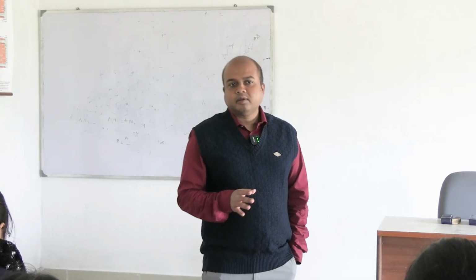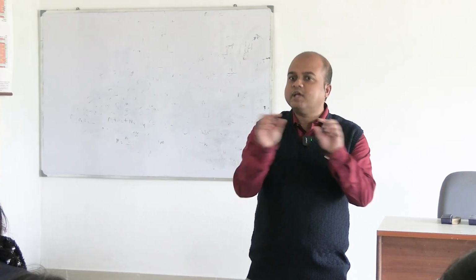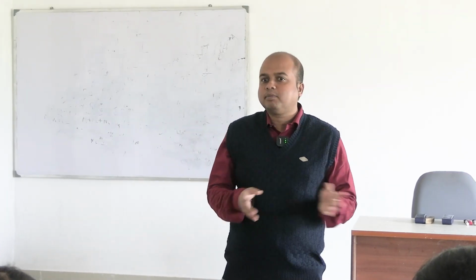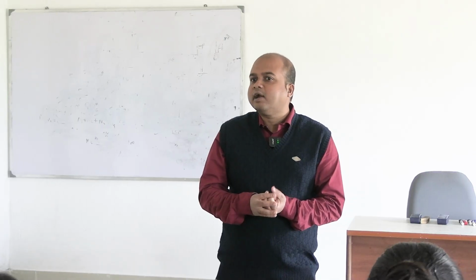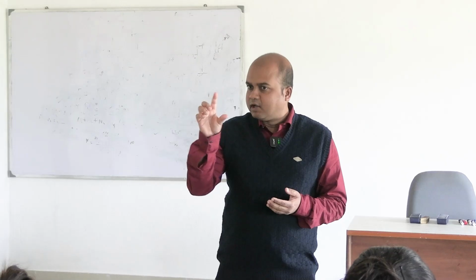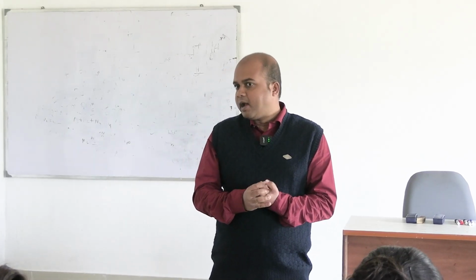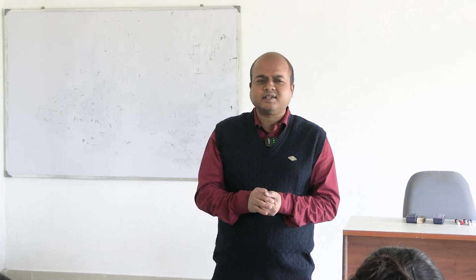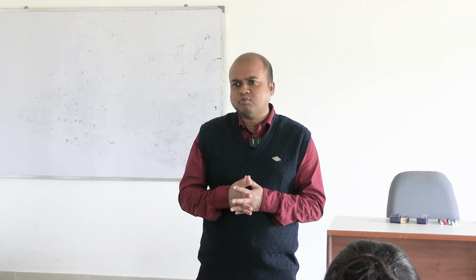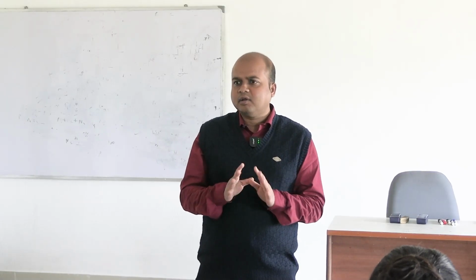First point should be the size of the bulb. When we compare the two pipettes, obviously the size of the bulb is greater. Some authors, or some of these practical textbooks, write about the stem, again meaning the lower part below the bulb: stem of the RBC pipette is narrower and the stem of the WBC pipette is larger, but at least in my eyes it is difficult to make out. Not very difficult, but leave that point.